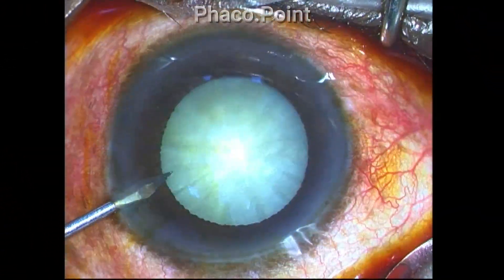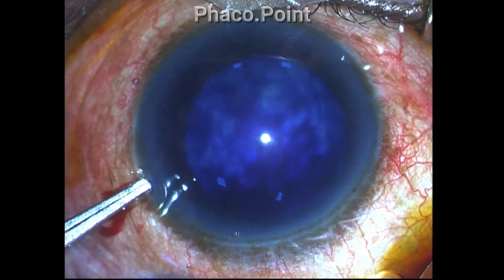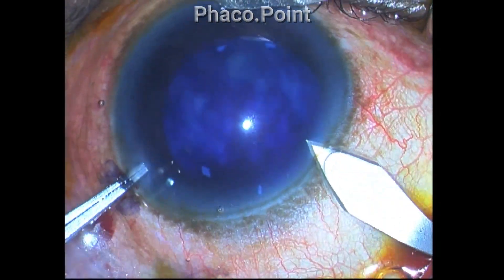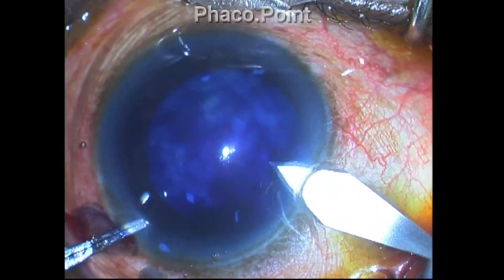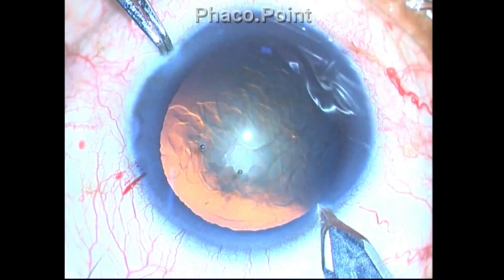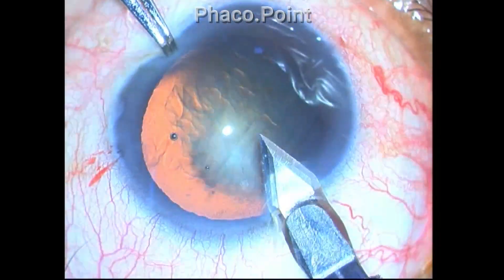Some surgeons take fixation through the side port incision. You can use an instrument through the side port — I am using a closed McPherson's forceps. This side port instrument should completely seal the side port to prevent leaking of viscoelastic, which would create hypotony. Tooth forceps can also be used, but apply only very gentle pressure on the eye. Do not give posterior pressure as the patient will appreciate it. Also ensure the keratome is brand new.